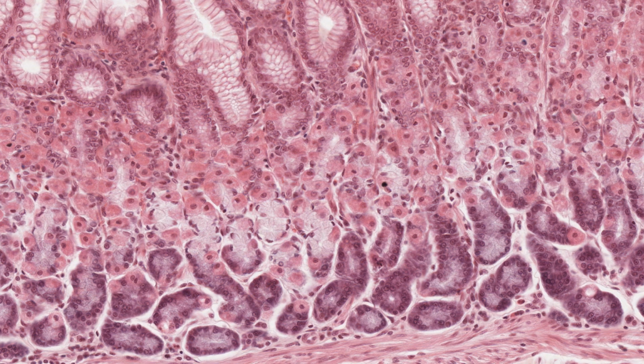The very dark pink stained cells, called parietal cells, exhibit acidophilia or eosinophilia. They're eosinophilic. They're reacting with the eosin dye. And a lot of the reason why these cells are staining a bright pink is because they are full of mitochondria, which are eosinophilic or acidophilic components of cells. And those mitochondria are very important in producing hydrochloric acid, which is a product of the stomach.